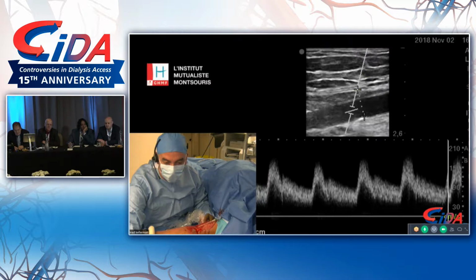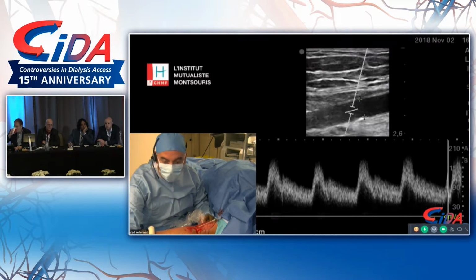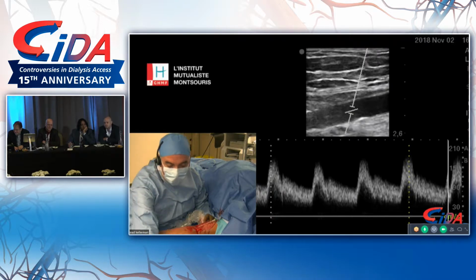Do you need to keep the patient in hospital overnight, or will they go home later this afternoon? No, it's definitely day surgery, and to be honest, I think in a few years we'll be able to do this in clinics. You see all these things here, we do it in surgery, but I think it's an overkill for sure. The procedure is so simple.